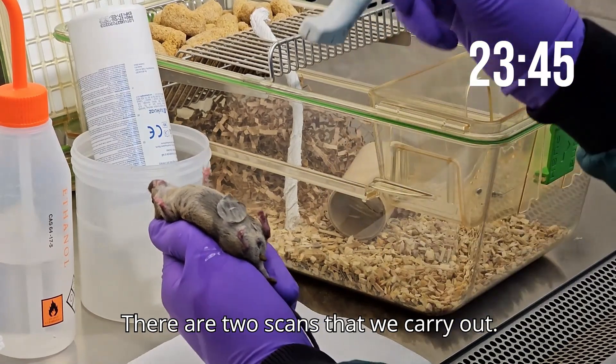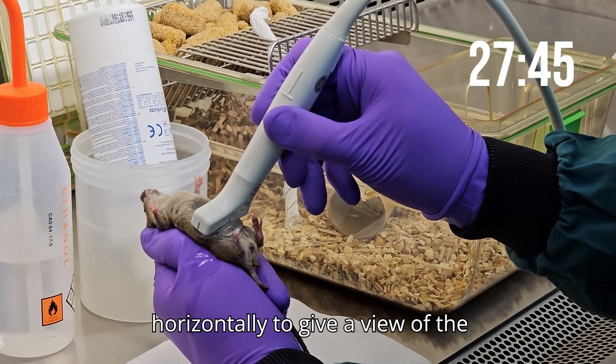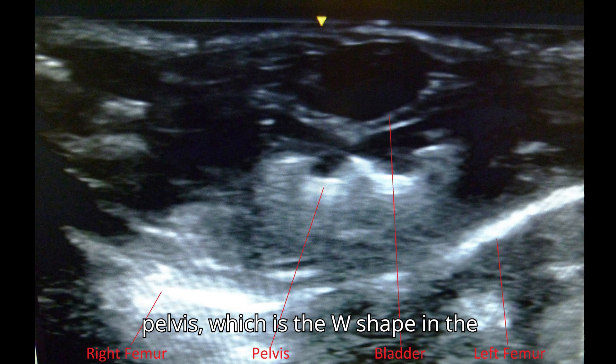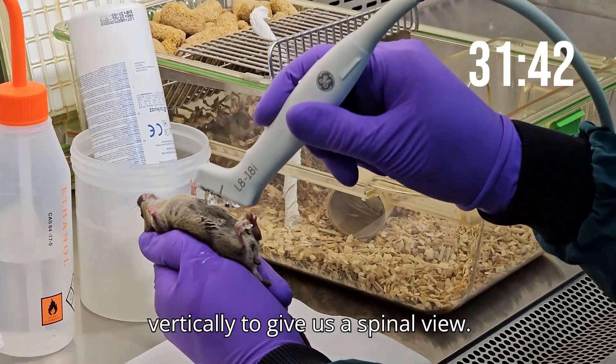There are two scans that we carry out. For the first, the probe is placed horizontally to give a view of the pelvis, which is the W shape in the middle of the screen. We then turn the probe vertically to give us a spinal view.